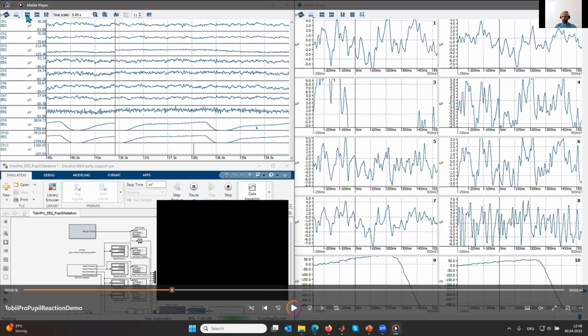And we just extract this online with the trigger block. Every time there is a stimulation onset, we extract some time before and afterwards, and then we average the reaction of the pupil and also the EEG. This is what we're going to see here.